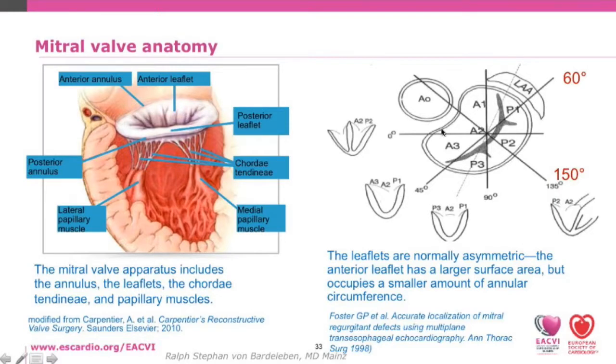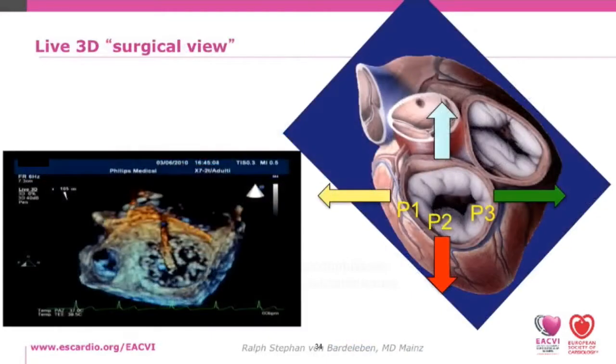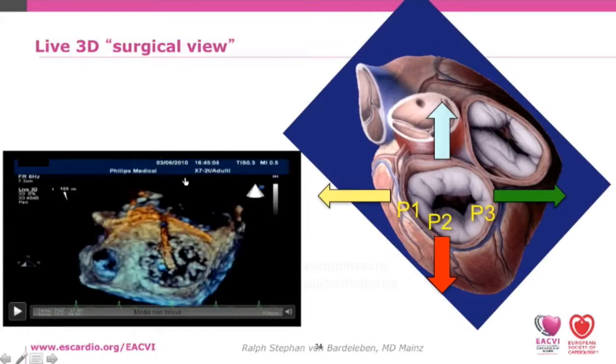And in order to see these different anatomic specifications, you of course can take two-dimensional images, as are the cut planes here. But in order to align the correct views to your two-dimensional views, you have to know the correct angulations in each of the specific patients. And this is very important and can easily be done and deduced from three-dimensional images. And this is given here, as you see. This is one of our early patients in mitral clipping.